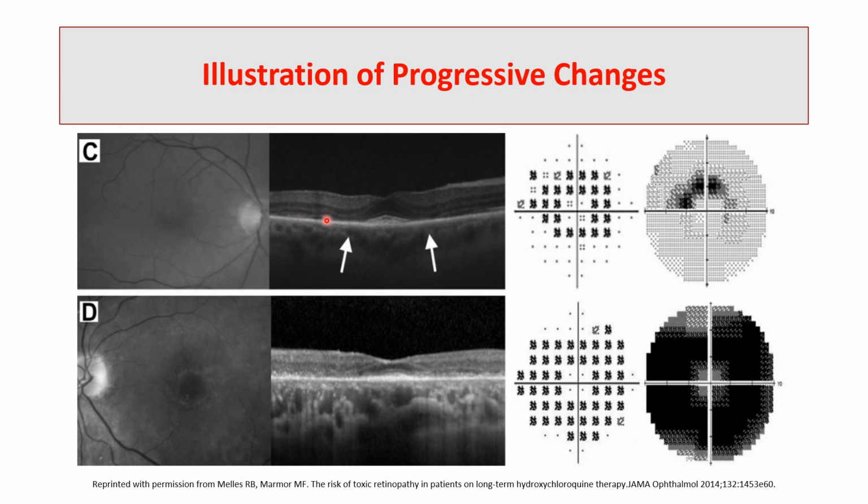With time, the patient had more severe loss in the parafoveal outer retinal layer with relative preservation of the central photoreceptors, leading to the flying saucer sign with an almost complete ring scotoma or partial ring scotoma. With time, this leads to advanced loss of the outer retinal layers with complete scotoma in the visual field and loss of the photoreceptors, and this patient will have very poor vision.